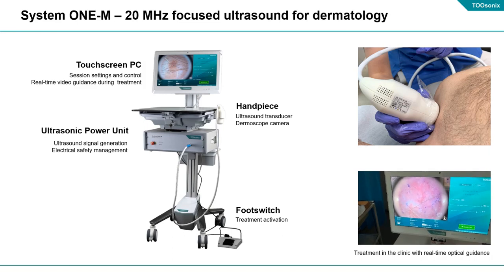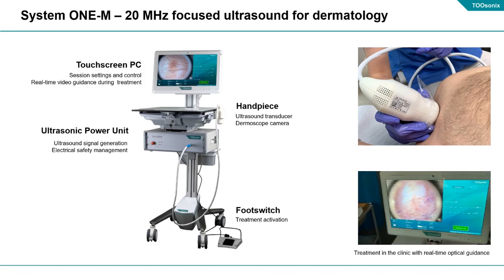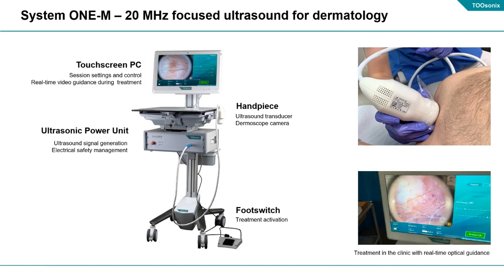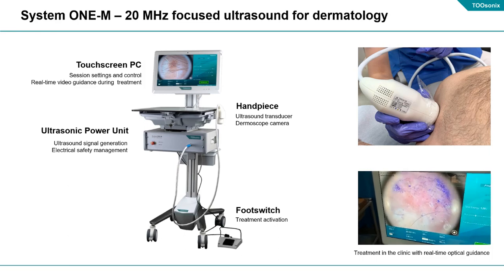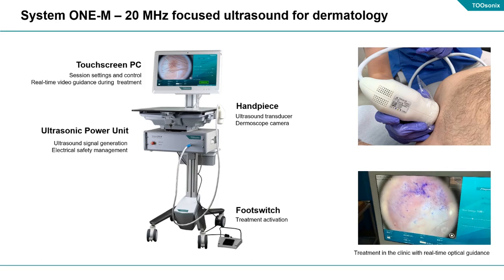Based on these considerations and calculations, our poster will demonstrate a device for dermatological therapy that works at 20 megahertz. The device is optimized for targets that are even smaller and located just in the very thin dermis and epidermis layers of the human skin. And since the targets are located at this very shallow depth, the system can utilize optical guidance instead of ultrasound or MR guidance and have direct visibility of the treatment as we treat in real time.